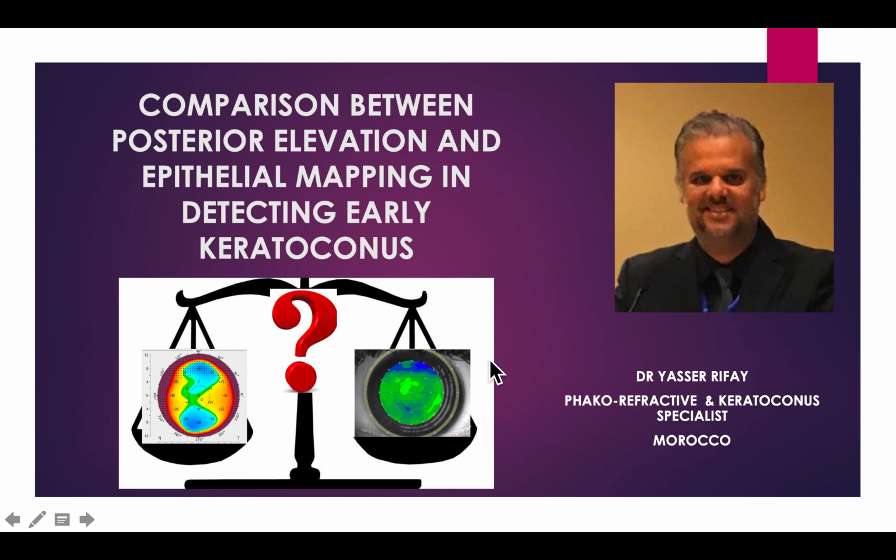I'm Dr. Rifai from Morocco, and I will present this comparison between posterior elevation and epithelial mapping in detecting early keratoconus. Which one of those is better to detect keratoconus in the early stage?